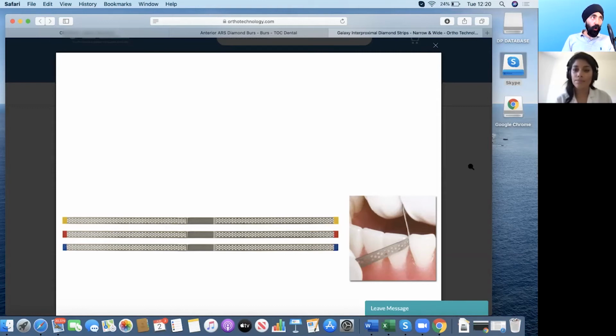Do you apply fluoride as a rule every time you do IPR? There are mixed views on this. There's some evidence to say it's good to reduce plaque formation and things like that, but other evidence to say it's unnecessary. I personally don't use fluoride unless someone is reporting that they get quite sensitive teeth beforehand. Otherwise I just recommend a sensitive fluoride toothpaste.